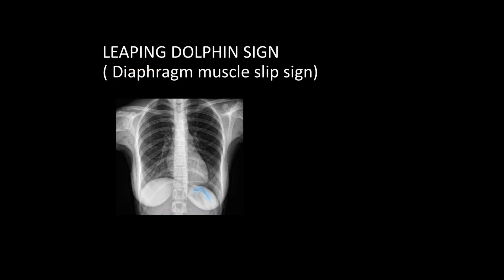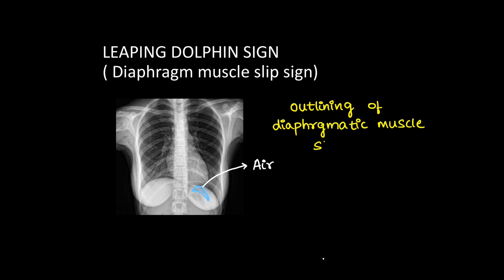Next we have the leaping dolphin sign. Here we can see a dolphin-shaped collection of air. The concept behind this is there is outlining of diaphragmatic muscle slips by free air, and hence they are seen prominently in the shape of a dolphin.